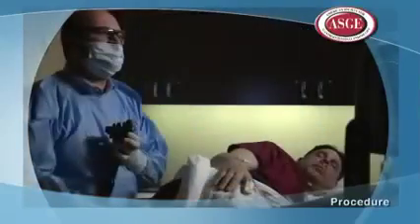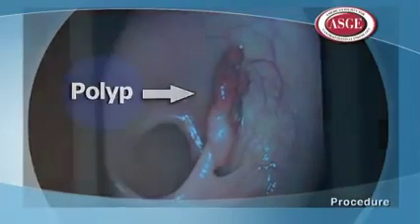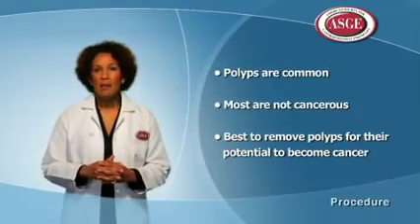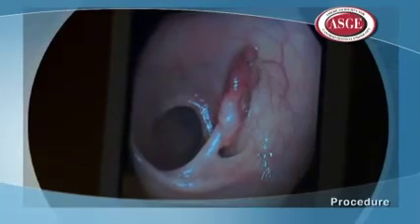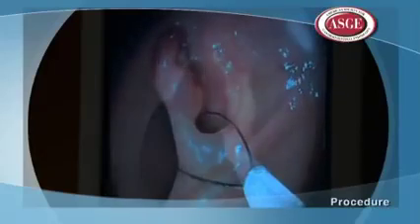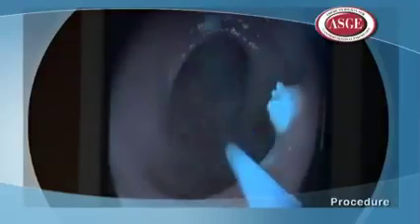Your doctor will be looking for abnormalities such as bleeding, polyps, and cancer. It's not uncommon to find polyps. Approximately 1/3 of men and 1/4 of women undergoing colonoscopy to screen for colon cancer will have polyps. Polyps are important because a majority of colon cancers develop from colon polyps. Most polyps are benign, meaning they are not cancerous. However, these polyps have the potential, in some cases, to turn into cancer, so it's best to have them removed. Colonoscopy removes the polyps before they can ever become cancer.